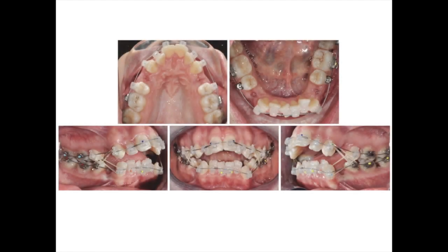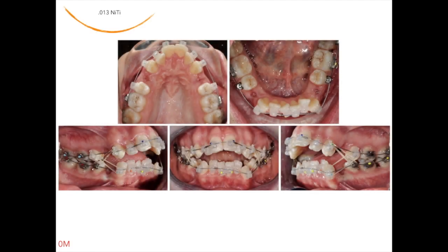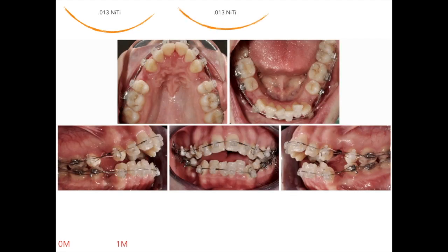We start off with a 0.013 CuNiTi wire and light elastics going from lower cuspids to upper cuspids to get the lower ones back in arch. A month later, we add four lace backs derived from the MBT technique, which are always useful when closing extraction spaces.